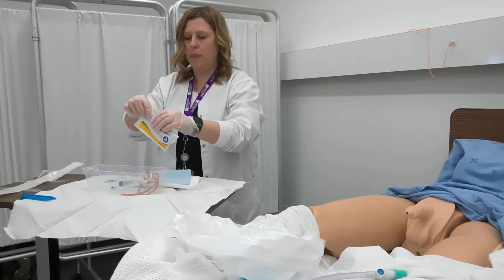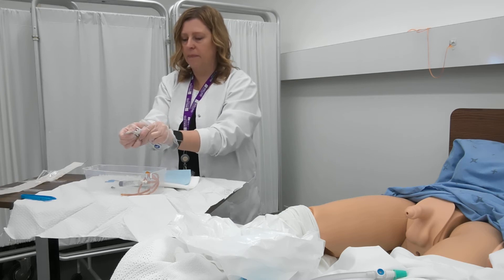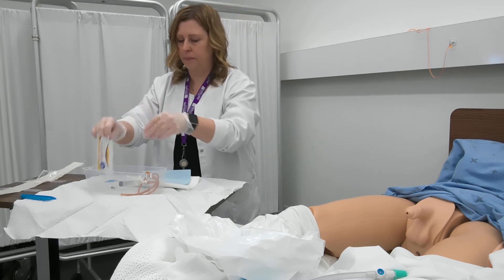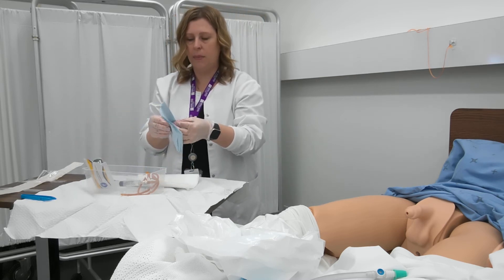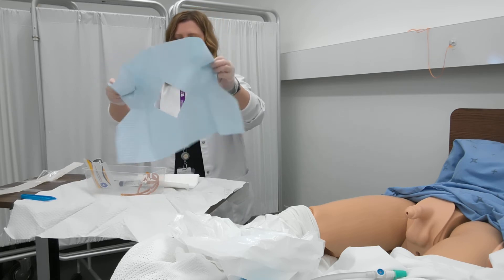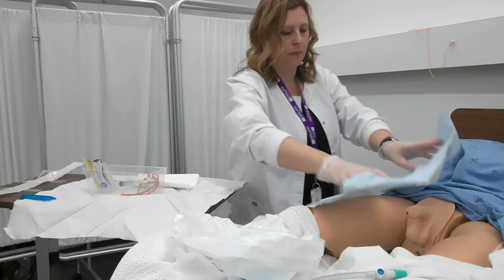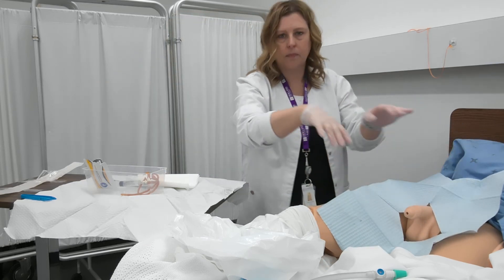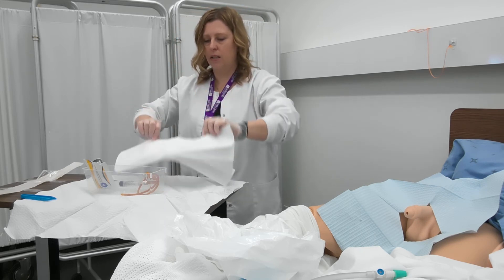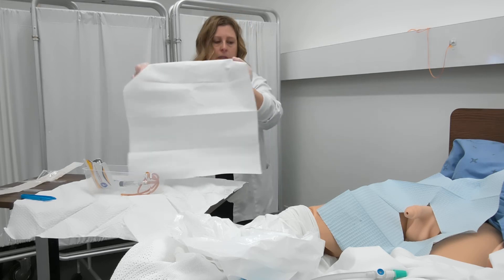I'm going to open up my cleaning solution to clean the perineum. I'm going to go ahead and place my drapes. This is a fenestrated drape — it's going to go over the penis like so. Then the next drape I'm going to place between the client's legs, and it's going to act as a sterile field.